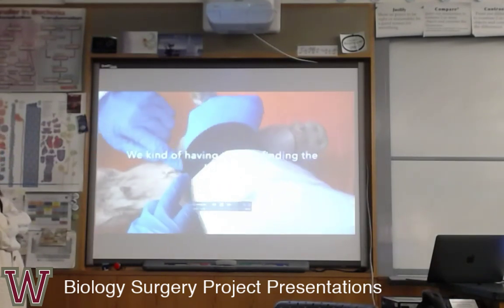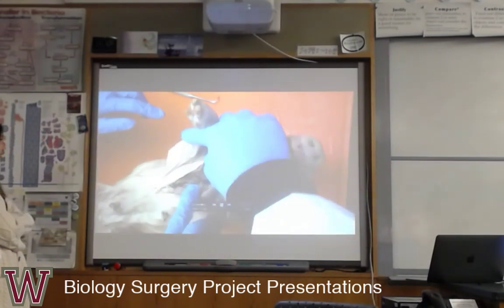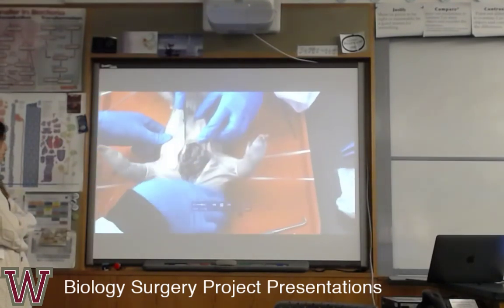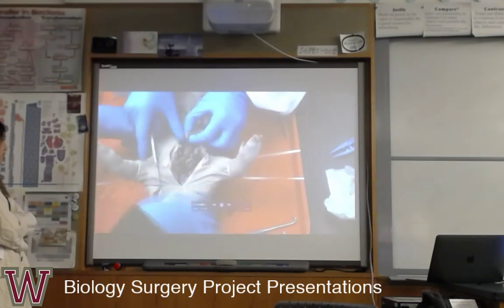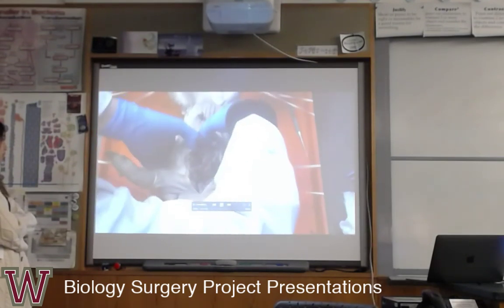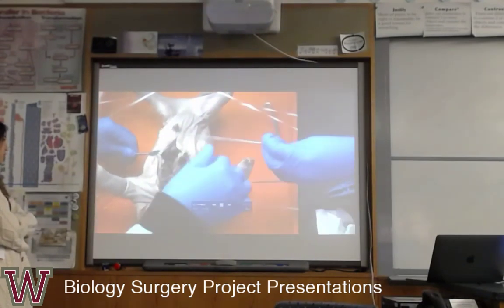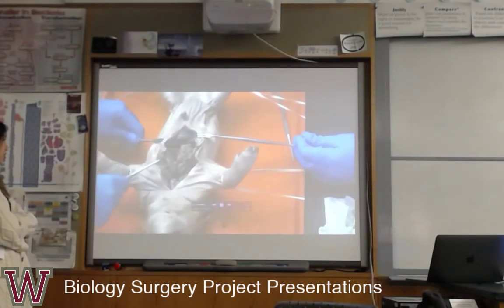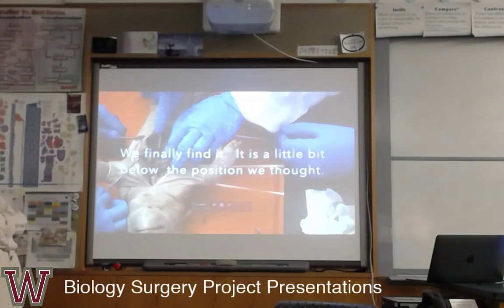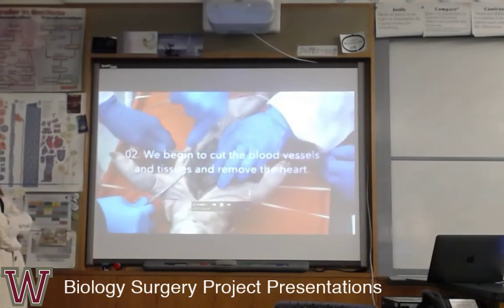We had trouble finding the heart at first, and we were afraid that we would cut the bones or cut through some of the most important arteries. Then we finally found it. Actually, it is a little bit below where we thought before, so we just made a longer cut, and then we found it.